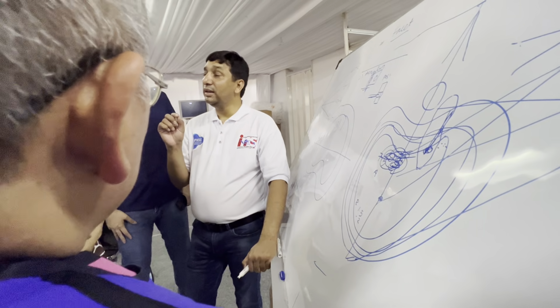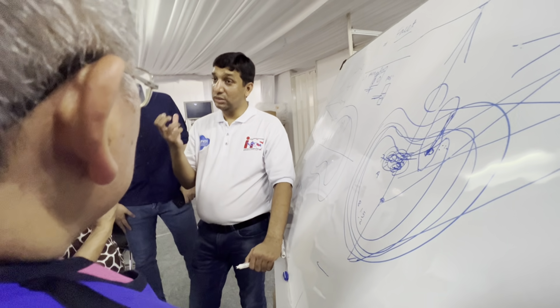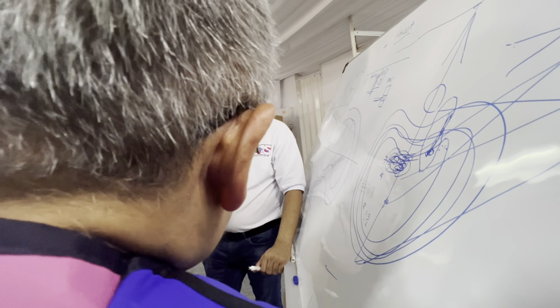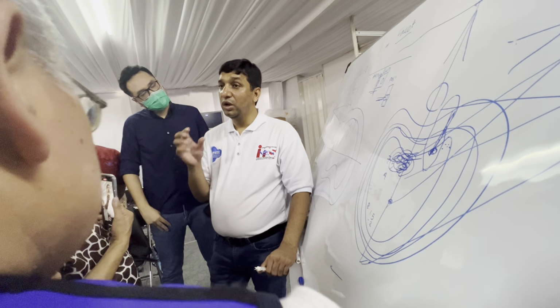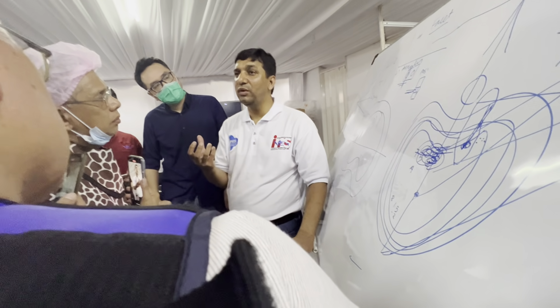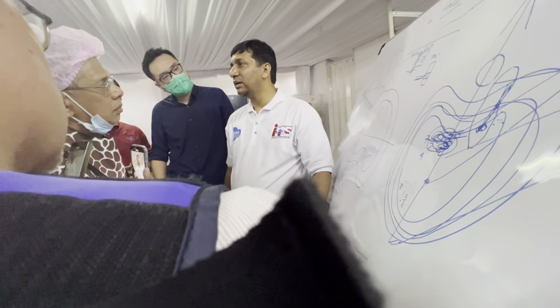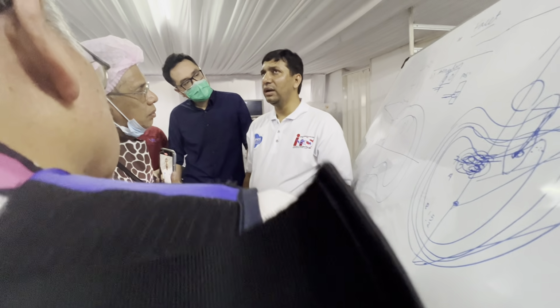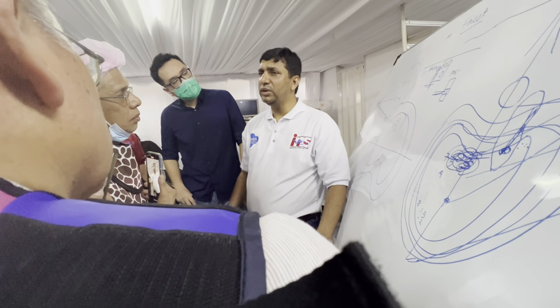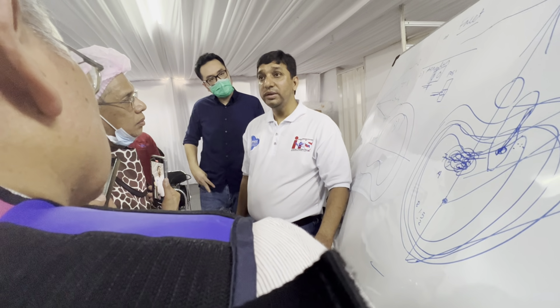Since I have used the local anesthetic solution, 0.5% lignocaine, which is very fast acting, even when I have injected half of the medicine, I ask the patient to move the leg and tell me how the leg is. If they say the pain is reduced, I even ask about the opposite side. If they say the opposite side is also okay.